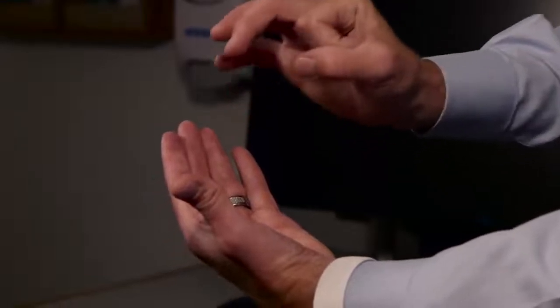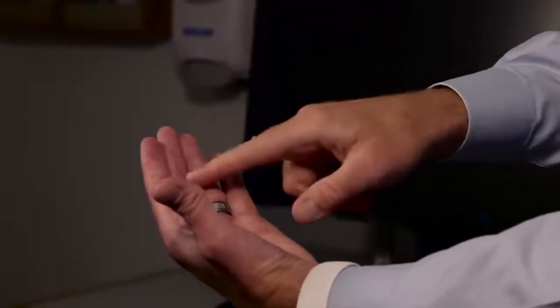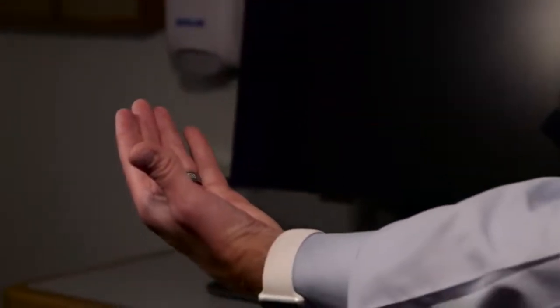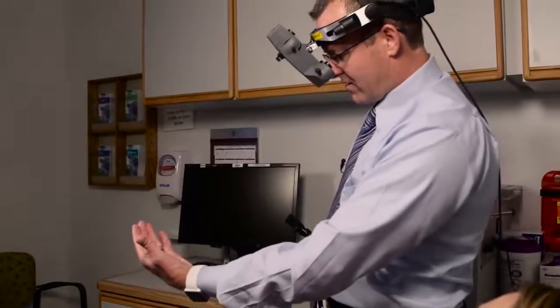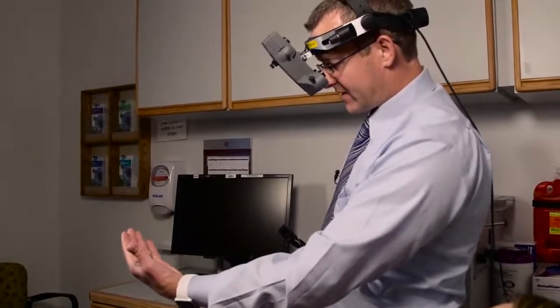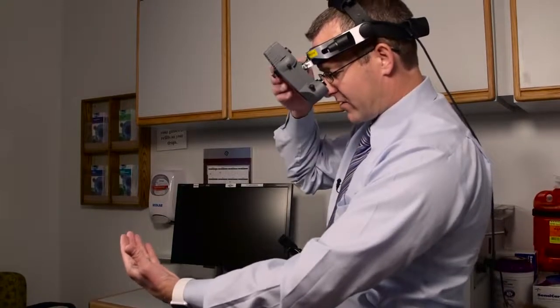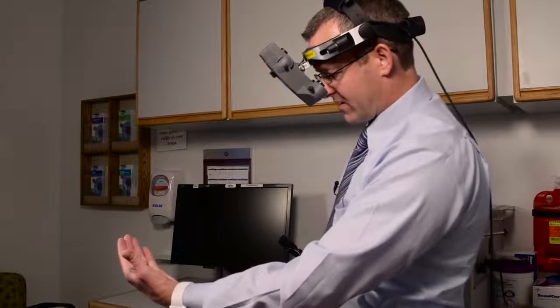In general, you're not going to use the narrow one very often. If there's a very, very small pupil, you might use the narrow beam, but it gives a very small view into the retina. So I basically never use that little teeny beam. The medium one I use for a lot of my exams except for when I'm doing a scleral depressed exam. When I'm doing a scleral depressed exam, I'll use the wide beam here.